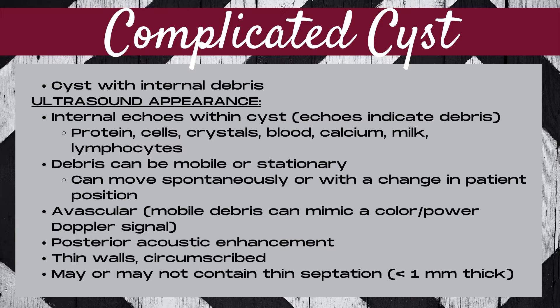The debris can move spontaneously on its own or may only move with a change in patient positioning. A complicated cyst should be avascular, although it's important to note that mobile debris within a complicated cyst can mimic color or power Doppler signal. The ultrasound machine incorrectly interprets the motion of debris as vascularity. A complicated cyst should have posterior acoustic enhancement, thin walls, and be circumscribed, and may contain thin septations less than one millimeter thick.